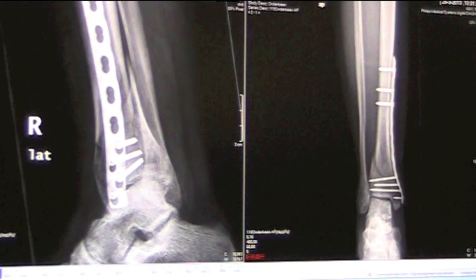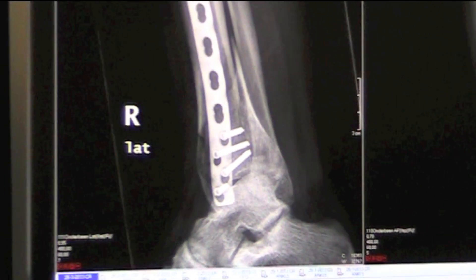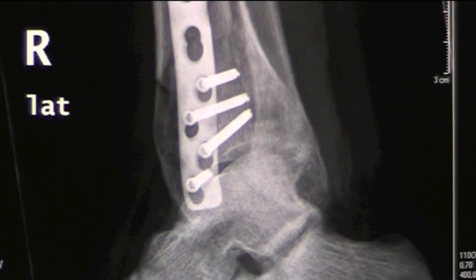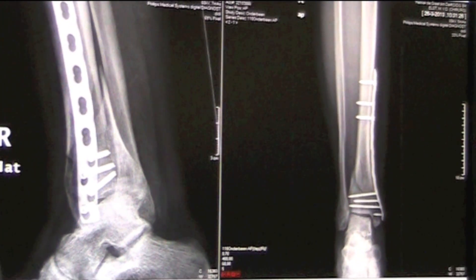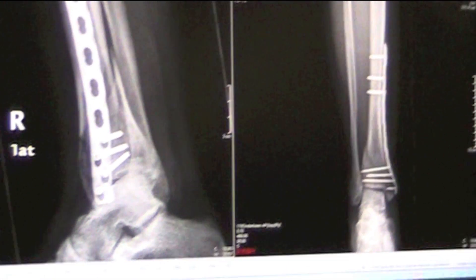That's why we refrain from loading it too early. The plate will stay in there forever in principle. Only if it gets severely infected and it's dangerous to leave it in, we'll take it out. But normally it will stay there because it's anatomically shaped — it's not like an external fixation.